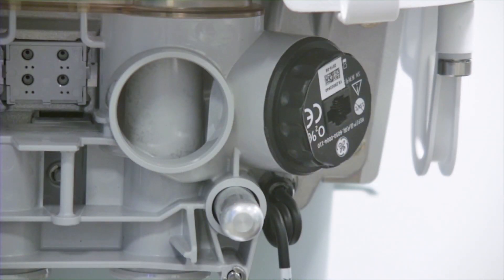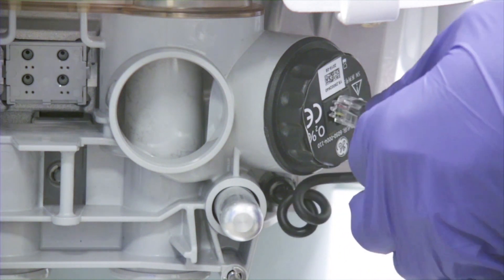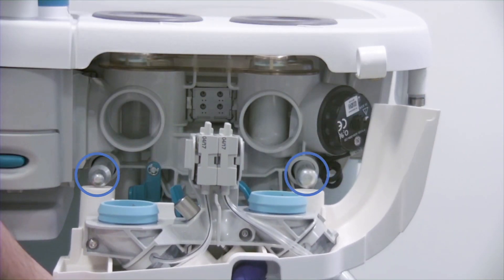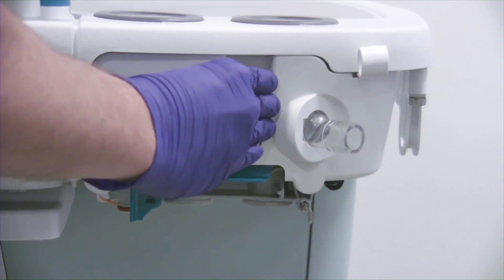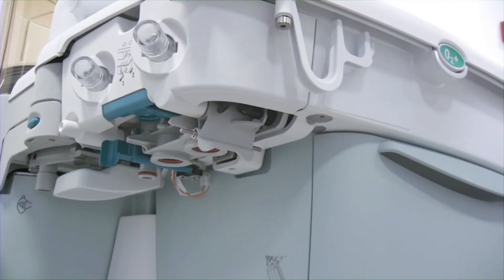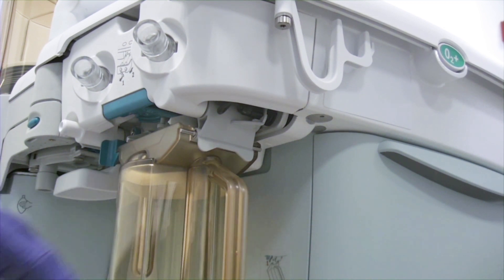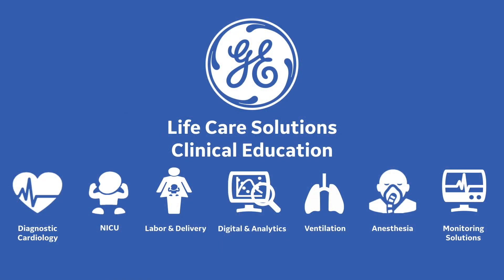If the anesthesia delivery system utilizes the O2 cell, it is recommended to replace the ABS without the flow sensor module. This allows access to the O2 cell and connection cable. Reattach the flow sensor module by aligning the guide pin openings on the flow sensor module with the guide pins, then press in firmly and close the latch. Reattach the absorber canister and make sure that the latch is secure.